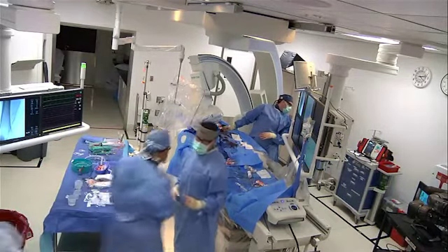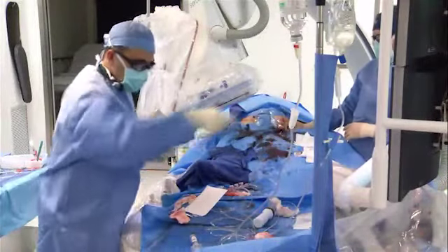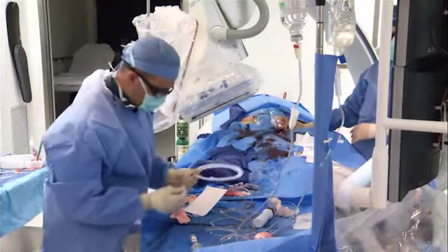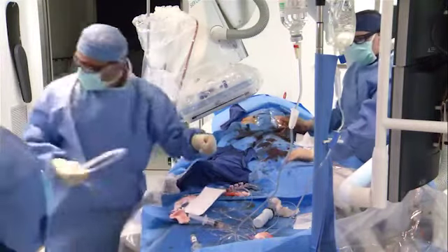So I'm going to go down with the 3-0 right now, hit that TP trunk, and then on the way out, we're going to go with the 6-0 and try to see if we can open that up a little bit.